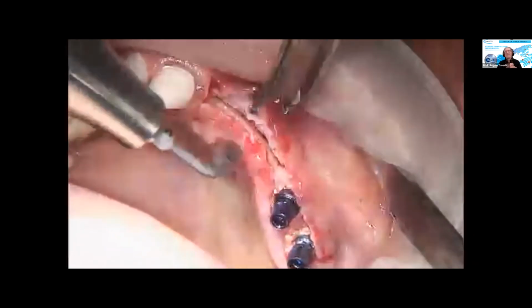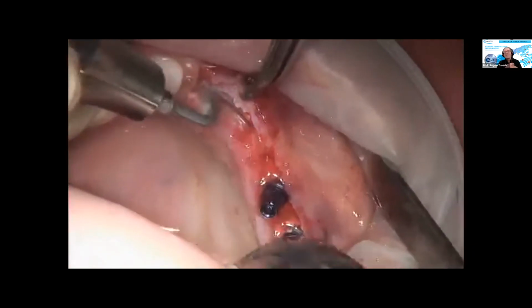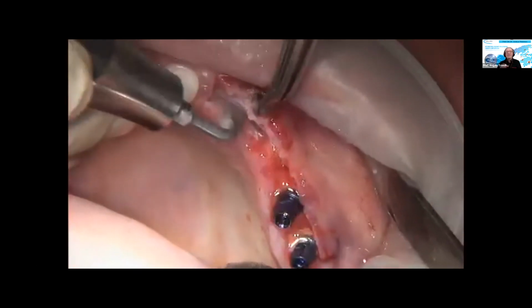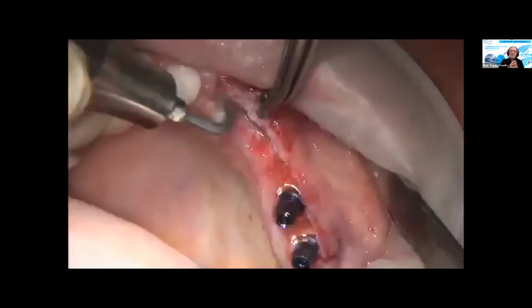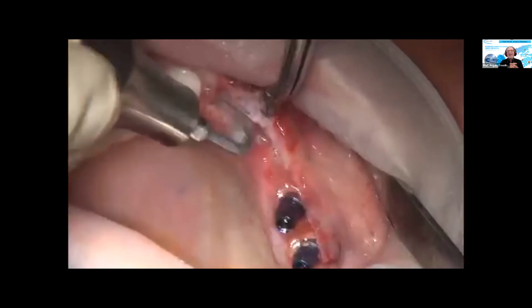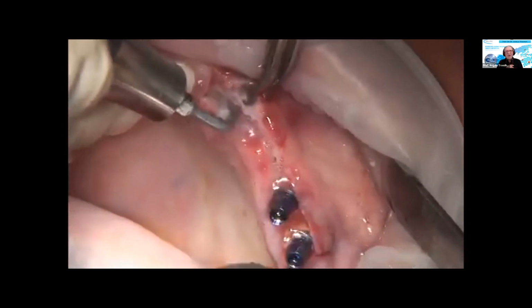As you have seen, this is almost real time. But since this was a live surgery, of course, I made a lot of comments. I was showing the participants here and there, and I cut this off from the video because, first of all, my comments were in German, so most of you wouldn't understand it. And of course, it's boring because we all know videos should not be too long.